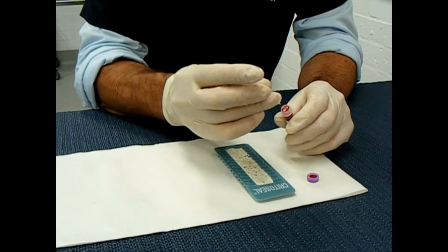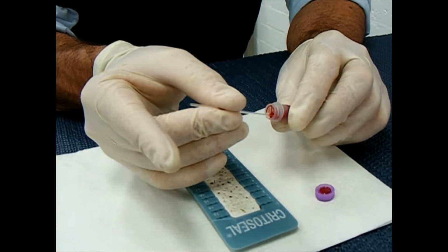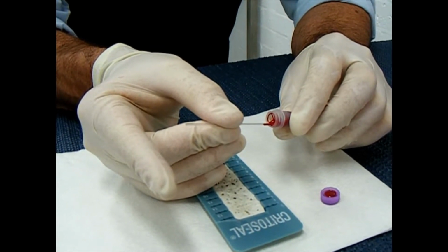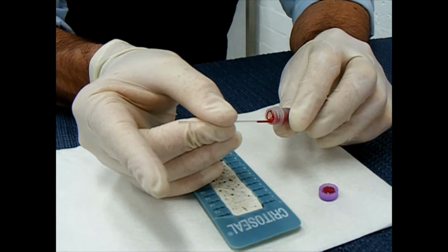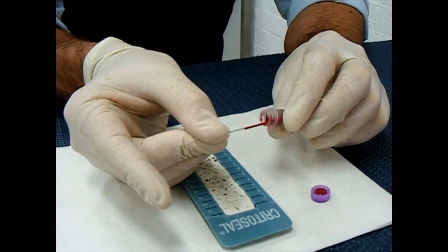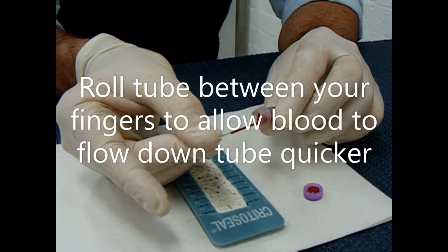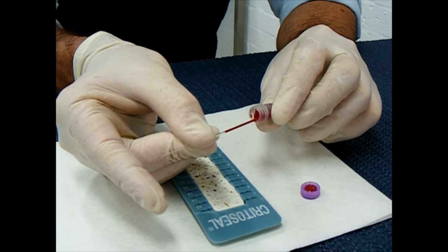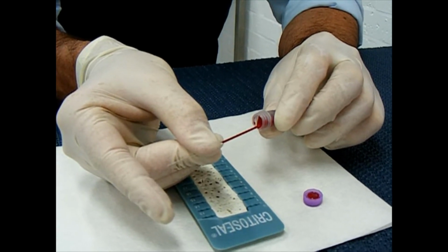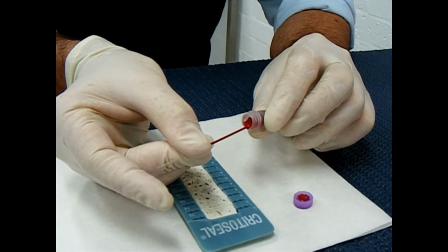I take the lid off, I put the capillary tube in the end, I have my finger off the end of the capillary tube, and then you do have to tilt it a little bit on the side, but you can see the blood is flowing uphill. You need to be patient, you need to be steady. As you tilt it a little bit further, the blood tends to run a little bit further. So you want to fill the tube at least halfway, preferably up to about 2/3 or 3/4 of the tube. That way you know you've got a good sample in there.